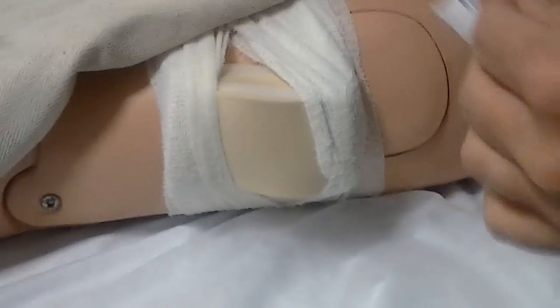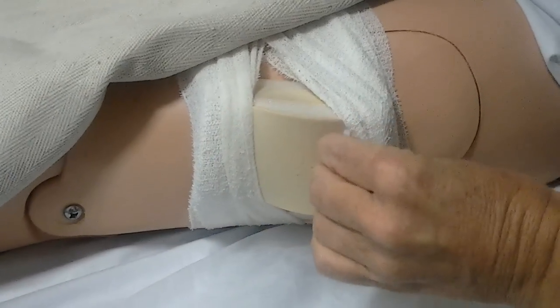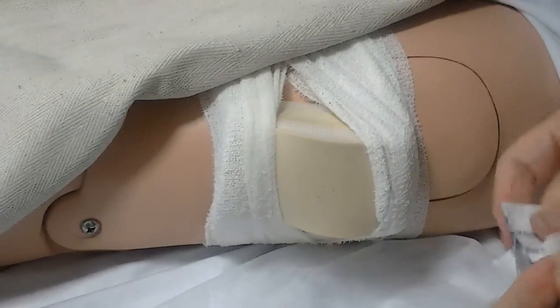Wash your hands. Wipe the site with the alcohol swab in a circular motion from inside to outside, clean to dirty.